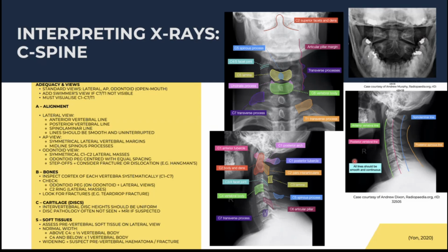However, I think it is important to look at them because sometimes you will have patients who come in, say, for follow-up C-spine imaging. We'll do things like flexion and extension views as well. But I think you've got to do a bit of X-ray with any of them. So we'll move on to CT and MR in a bit.